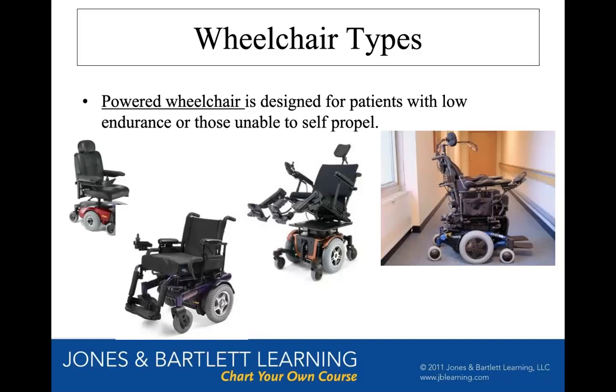So the wheelchair in the center of the screen here that's tilted back, with the orange base, I can see the joystick, but it's got a big enough headrest that it's probably a head-driven wheelchair too. Those types of wheelchairs usually also have supports, little bars and pads that come up to their foreheads, and they rest right above the forehead without touching it.